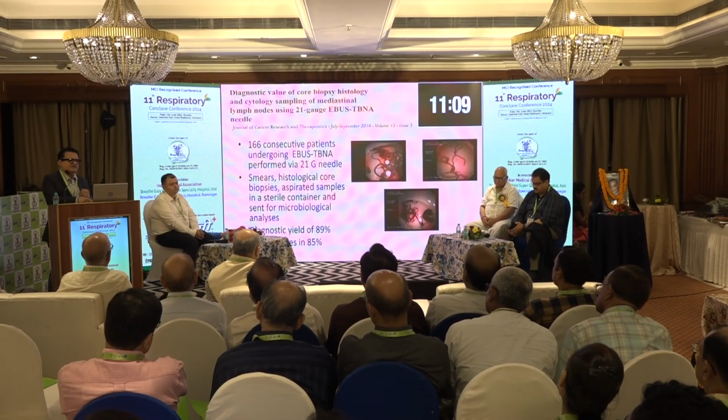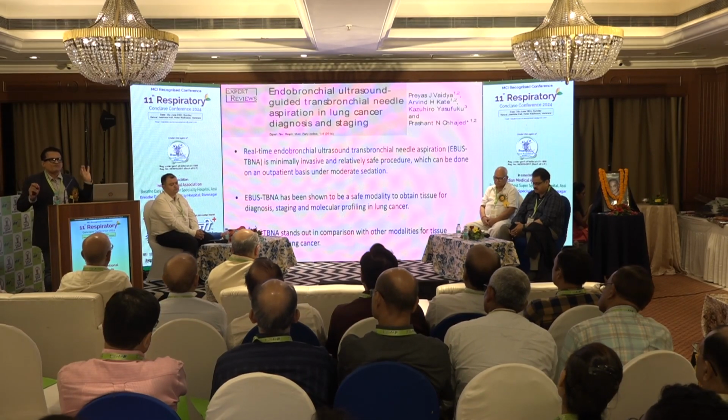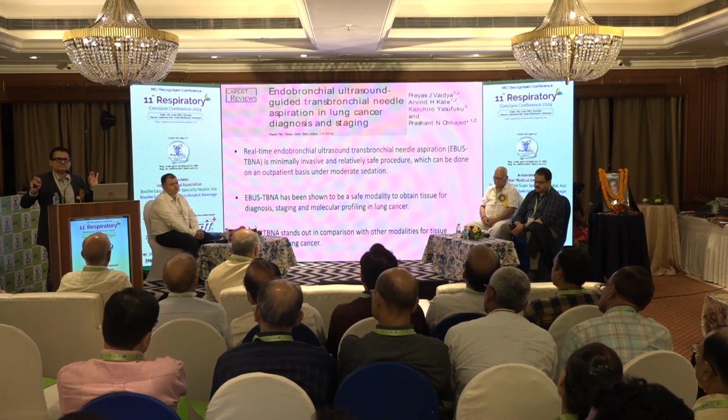therapy. This is the paper which we've published using a 21 gauge needle. These are the good biopsies which you can get with EBUS TBNA, and that gives you enough material. And all these procedures are done in the endoscopy suite. Patients go back home. From entry to exit is 6 hours. Okay, so they go as a daycare procedure.